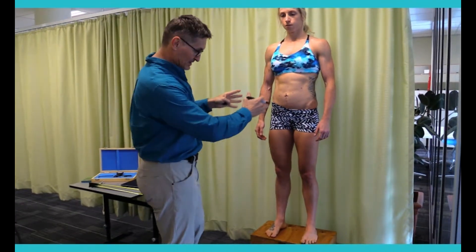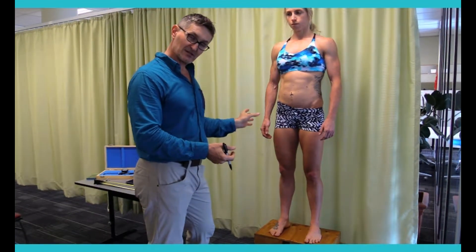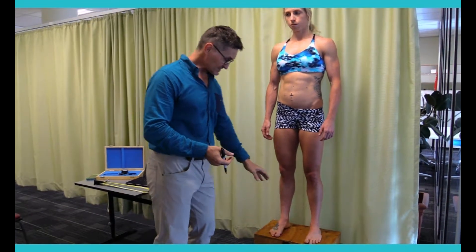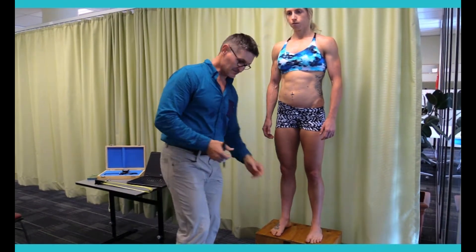If you look at the way that her legs run, we're going to ensure if that tape is running perpendicular to the long axis of the leg, it's actually going to be a little bit lower medially compared to laterally. Let's get it set up.